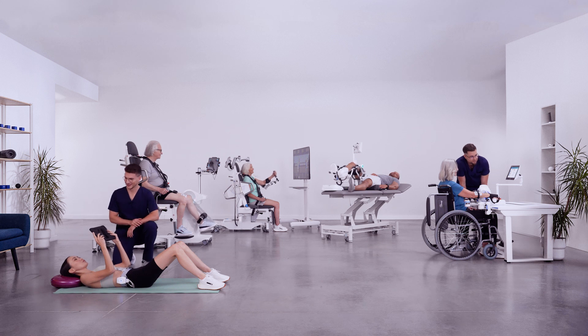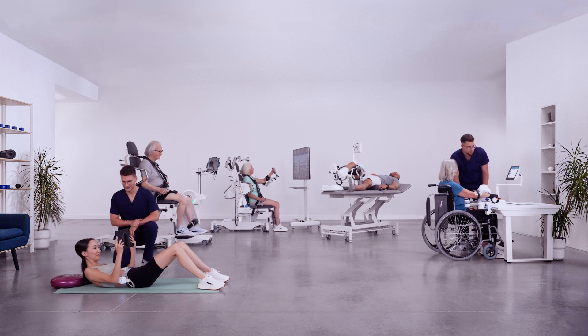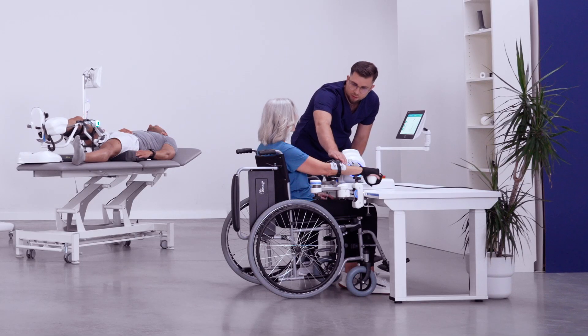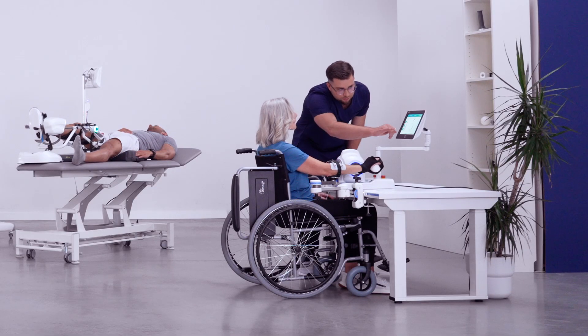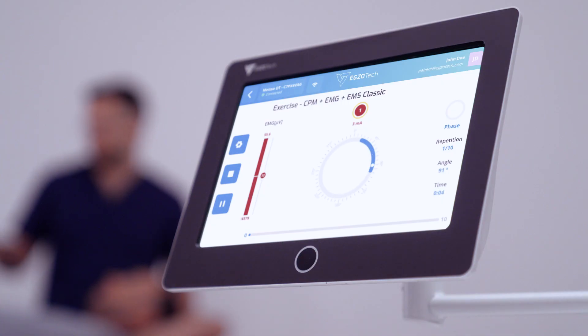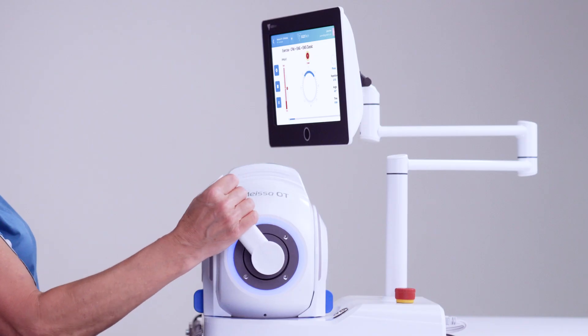We know that the rehabilitation process can be challenging, especially restoring the function of the upper limb. Hand therapy can be really difficult after a stroke, but also after injuries or surgeries. This is why we've created Meissa OT, a robotic device for upper limb rehabilitation.